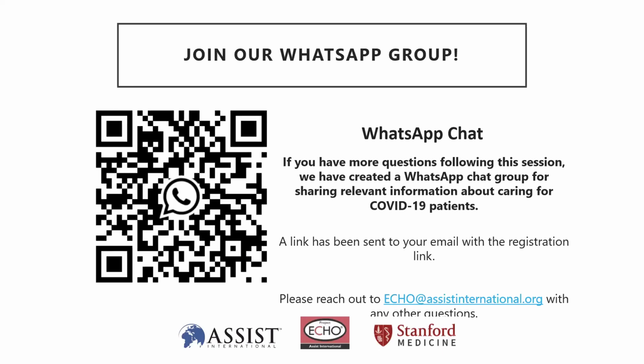Lucy is asking the best way to determine oxygen needs in a patient with an SpO2 greater than 90%. I think that if your SpO2 is greater than 90% and the patient is not on oxygen, then you need to assess the clinical signs and symptoms of respiratory distress. If the patient is on oxygen, then you want to leave them on the oxygen as long as their SpO2 is above 90%. Again, we would have a higher goal in pregnant patients of 92 to 94%. So if the patient's saturation is 90%, you would want to increase the amount of oxygen that you're delivering to that patient.